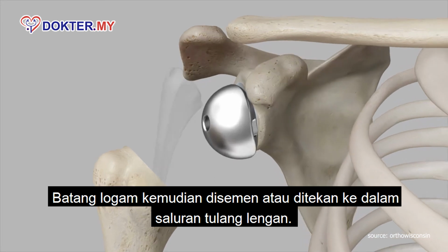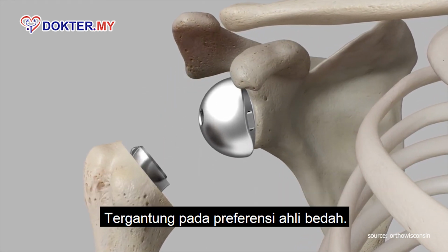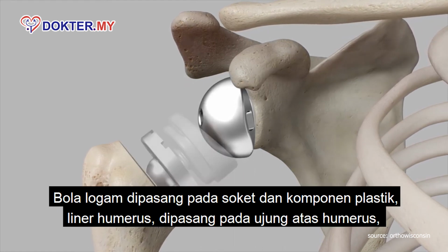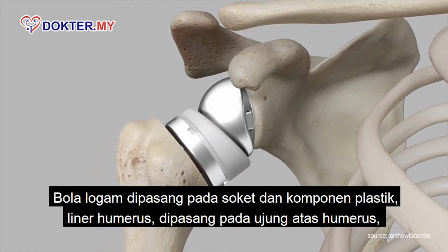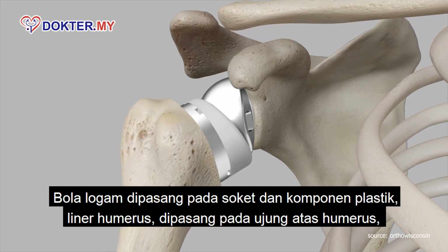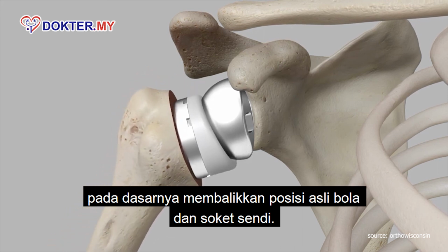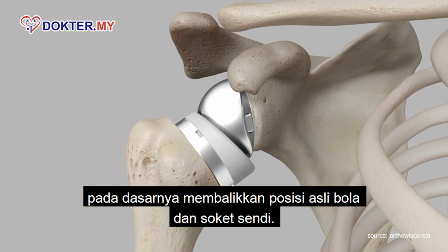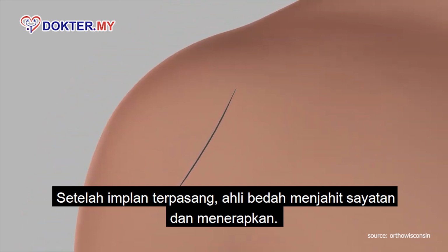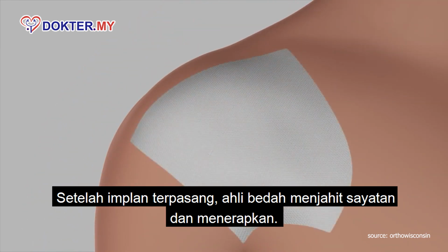A metal stem is then cemented or press-fit into the canal of the arm bone, depending on the surgeon's preference. The metal ball is fixed to the socket, and a plastic component, the humeral liner, is fixed to the upper end of the humerus, essentially reversing the ball and socket joint's original position. Once the implant is in place, the surgeon sutures the incision and applies a dressing.